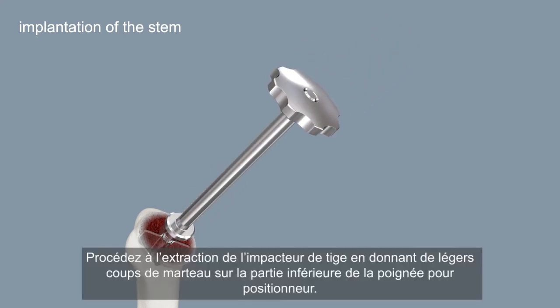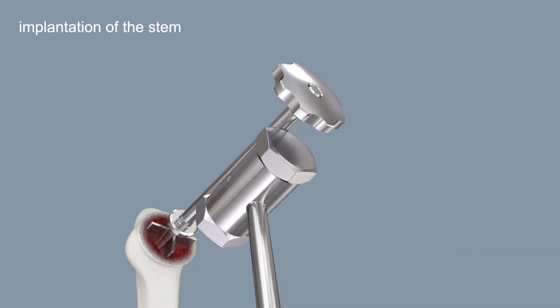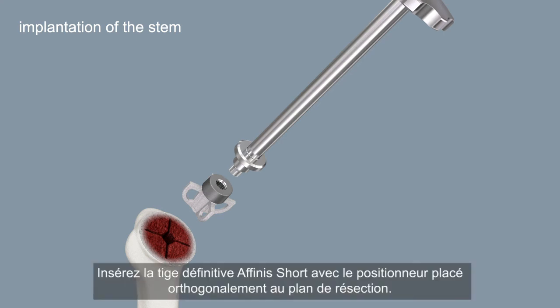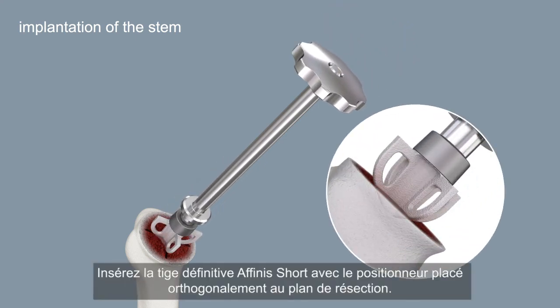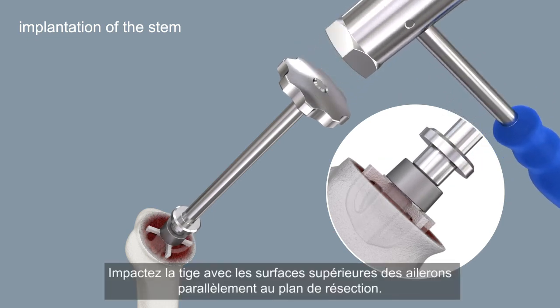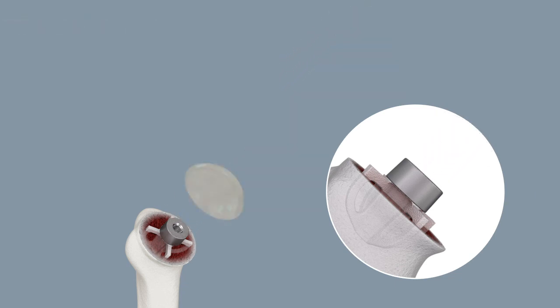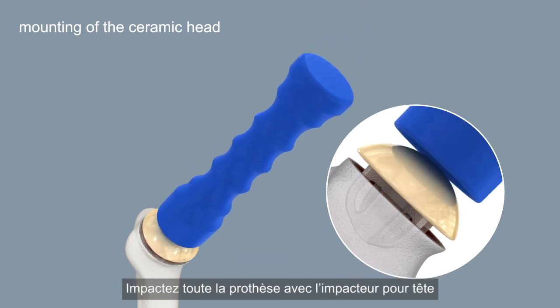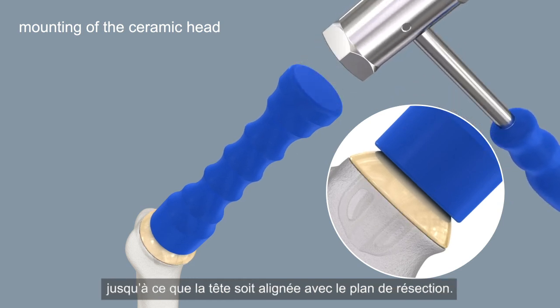Pull off the stem impactor with slight hammer strokes on the underside of the positioner handle. Insert the final Affinis short stem with the positioner orthogonally to the resection plane. Impact the stem with the upper fin surfaces parallel to the resection plane. Mount the ceramic head manually with a pushing and rotational movement. Impact the whole prosthesis with the head impactor until the head is flush on the resection plane.